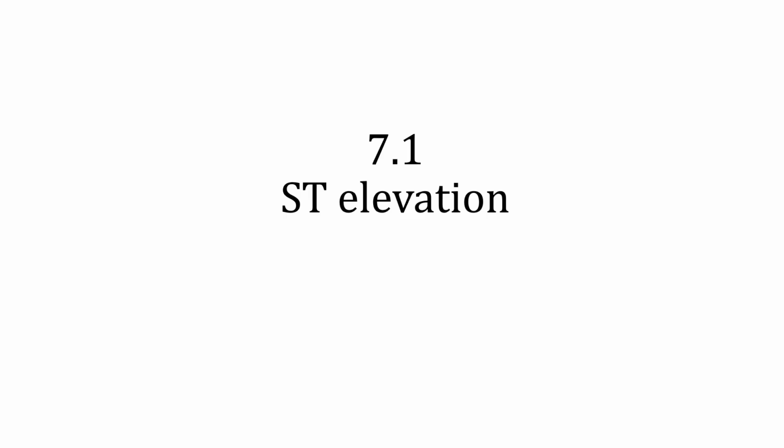Next up is 7.1, in which we will focus on ST segment elevations that are associated with myocardial infarctions.